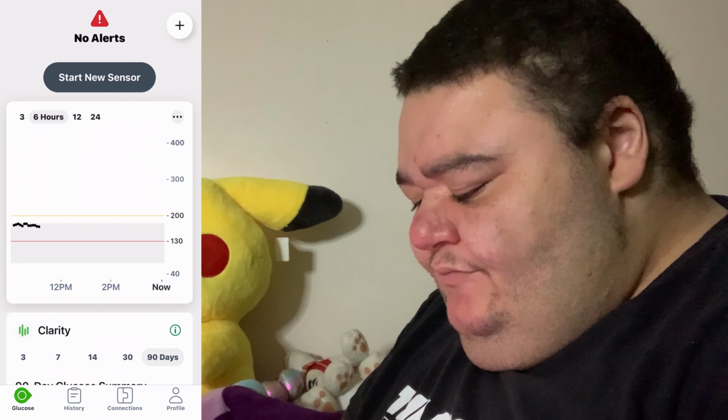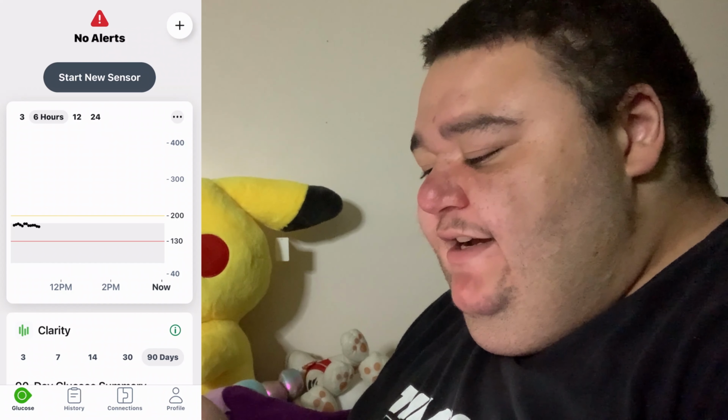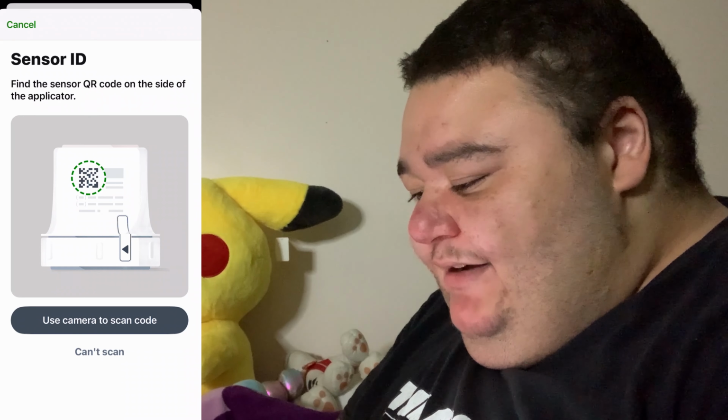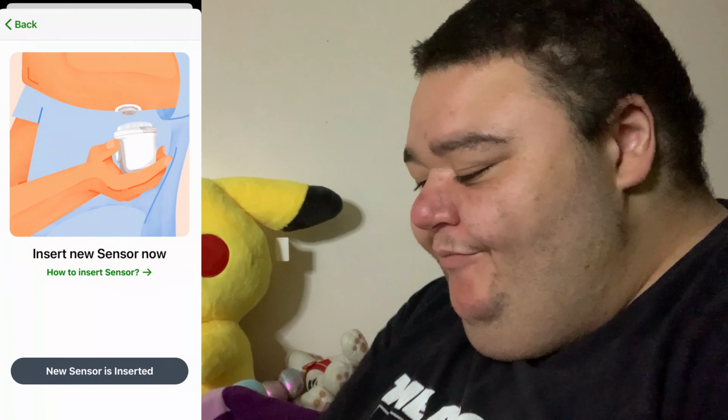Alrighty, let's do this on the iPhone. I was going to sit on my chair for this, but I'm going to stay here on my bed. I'm going to do this screen recording right now, so you guys will see the Dexcom app coming up in a few seconds. Since it says start new sensor, I just click to start sensor and then scan the QR code on the sensor hub here.